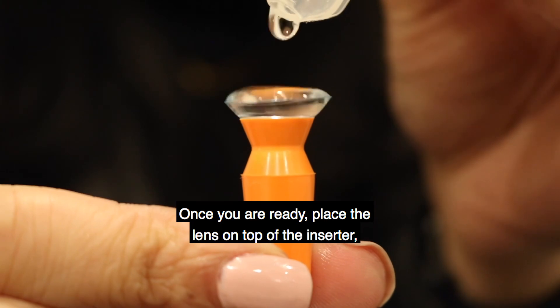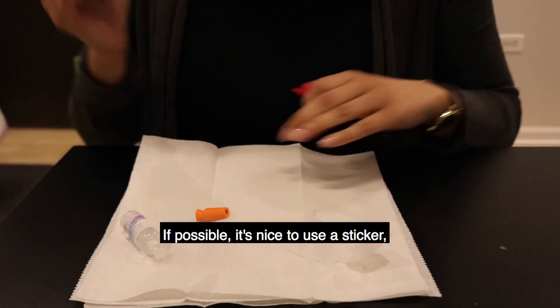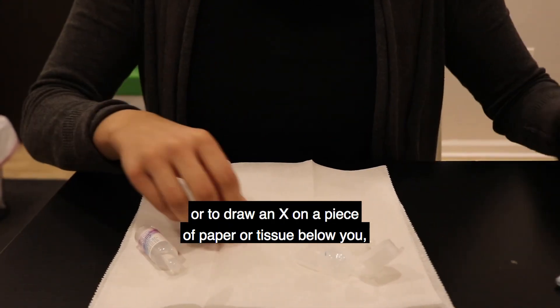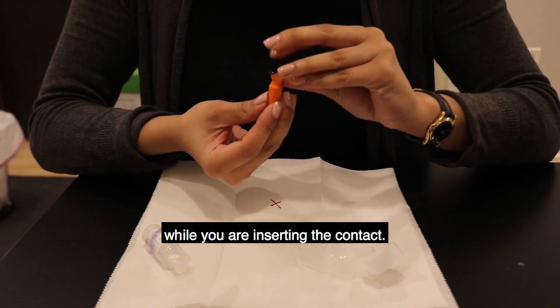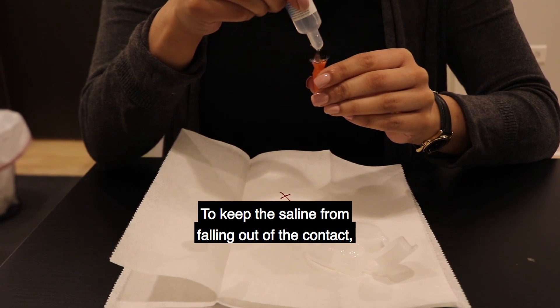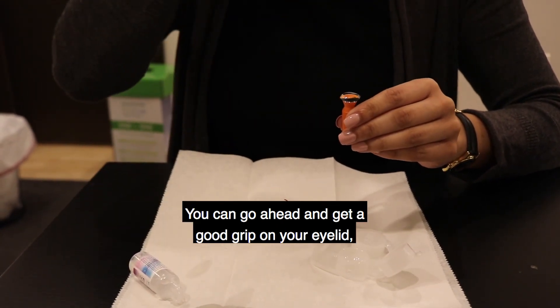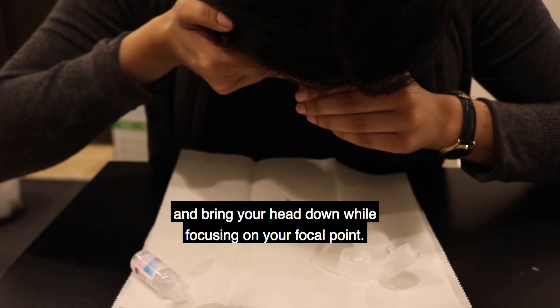Once you are ready, place the lens on top of the inserter and fill the bowl with saline solution. If possible, it's nice to use a sticker or to draw an X on a piece of paper or tissue below you to give you something to focus on while you are inserting the contact. To keep the saline from falling out of the contact, make sure to not lift the inserter to the eye until your head is parallel with the floor. You can go ahead and get a good grip on your eyelid and bring your head down while focusing on your focal point.